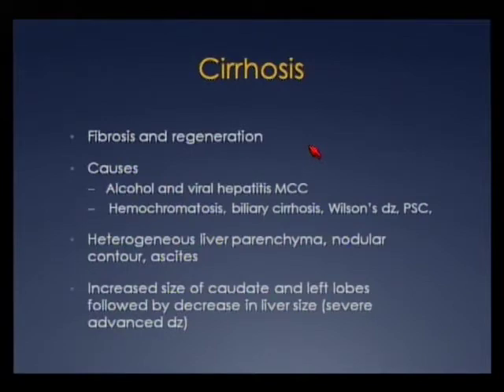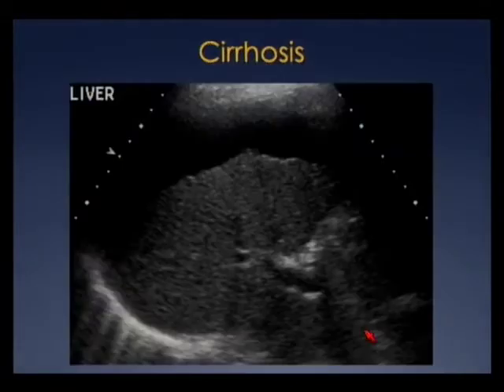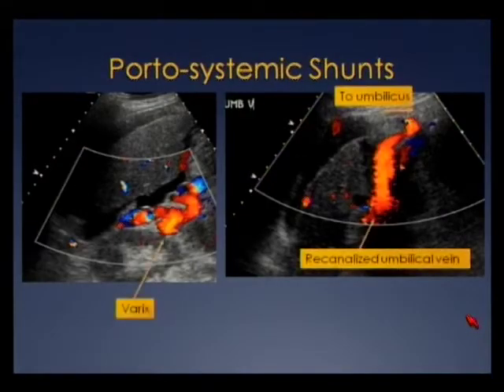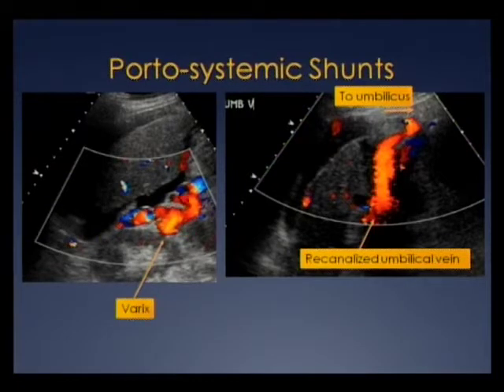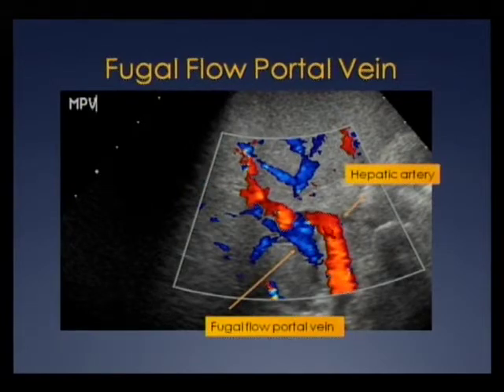Cirrhosis is fibrosis and regeneration of the liver; the most common causes are alcohol and viral hepatitis. In advanced cases we typically see heterogeneous liver parenchyma, nodular contour, and ascites, with increased size of the caudate and left lobes followed by overall decrease in liver size. Here's a nice case of advanced cirrhosis with ascites and nodular, shrunken liver. We can also see vascular complications — varices, recanalized paraumbilical veins, and in one patient, blue representing hepatofugal flow in the portal vein with a dilated hepatic artery from portal hypertension.